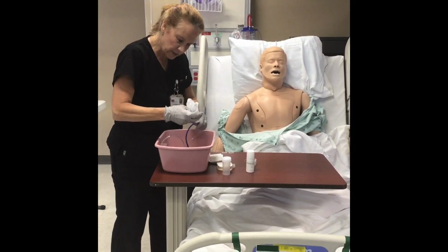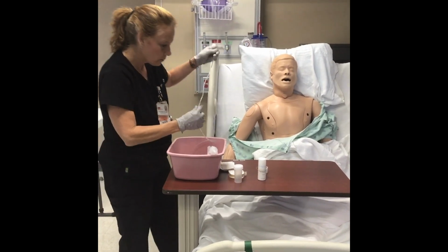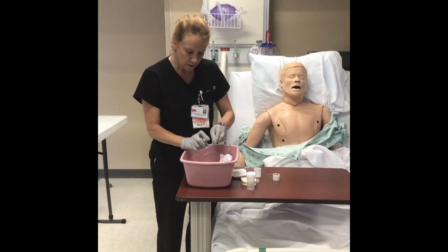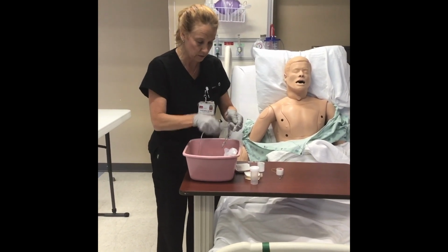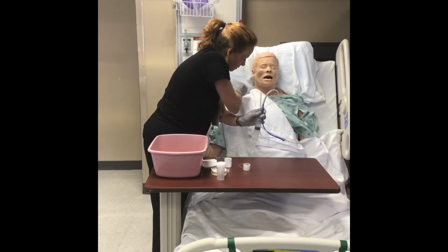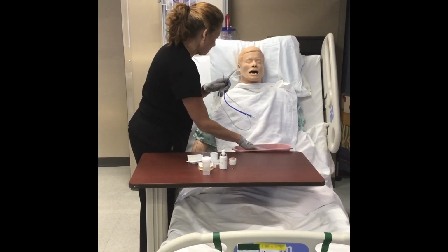Next, I'm going to put the syringe onto the end of the NG tube because you want to prepare your supplies as efficiently as possible so that you're not doing that with one hand. Next, I'm going to lubricate the tube. And this lubrication is very, very slippery, so when you're lubricating, just make sure that you are spraying into the bucket and not on the floor because we certainly do not want any accidents to occur. Okay, I'm going to put your gown up here, put the towel back up here. And here is a bucket right here. So just in case you feel as if you might be getting sick, this is where I want you to vomit, okay?